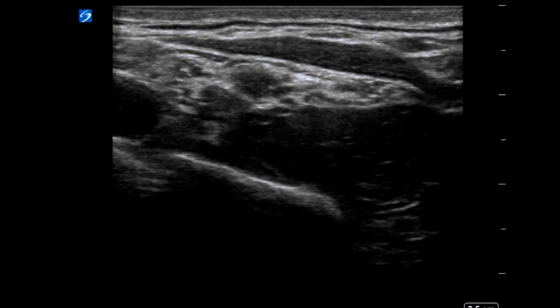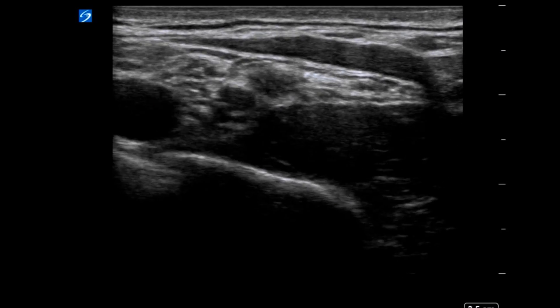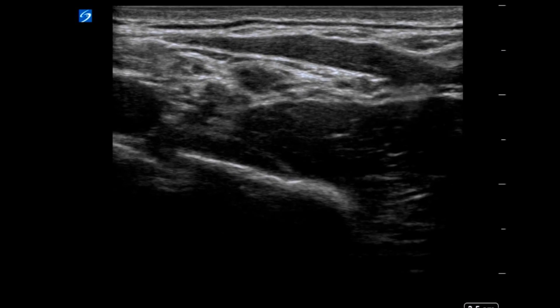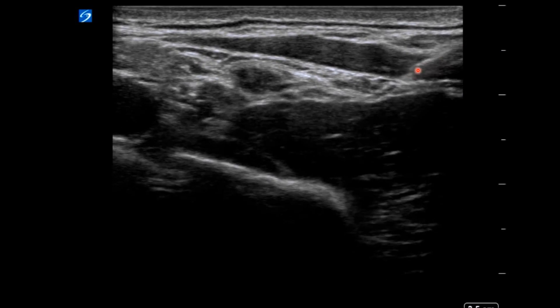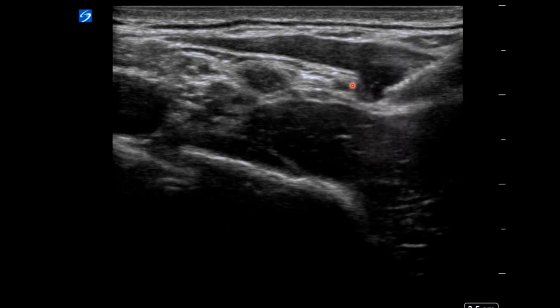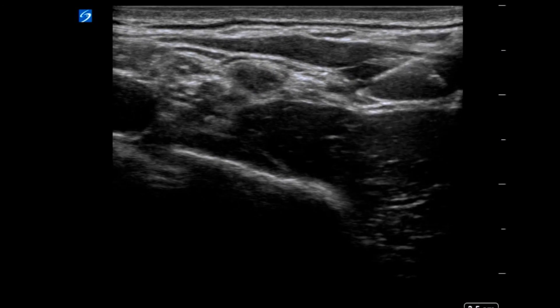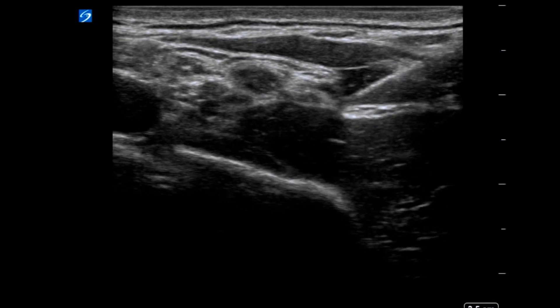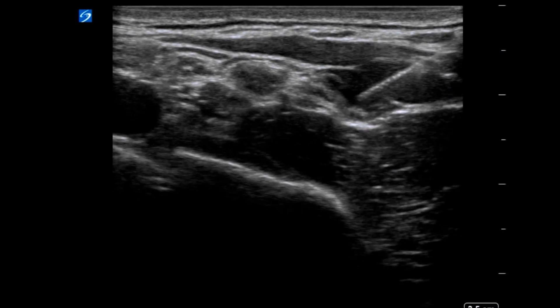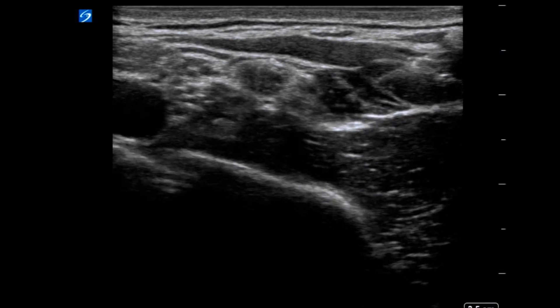This is a demonstration of the anterior approach to the suprascapular nerve block. The subclavian artery, pleura, and first rib are identified. The needle approaches from a lateral-to-medial direction under the omohyoid, where the suprascapular nerve has branched out from the superior trunk. The needle penetrates the superficial cervical fascia, and typical volumes of 2 to 5 milliliters are sufficient to surround the suprascapular nerve at this location.